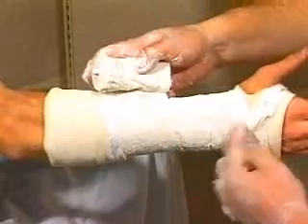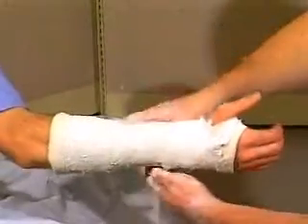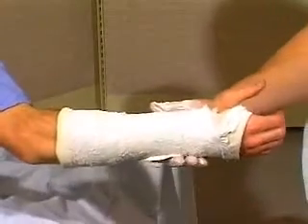Wrap the plaster proximally, overlapping the previous layer by two thirds to have a minimum three layers thickness. Excess material along one edge can be lifted, tucked and folded away from the plaster roll to keep the layer flat against the limb. Smooth the plaster to consolidate the layers.